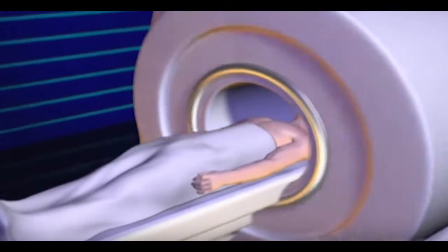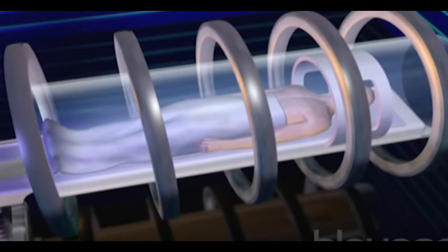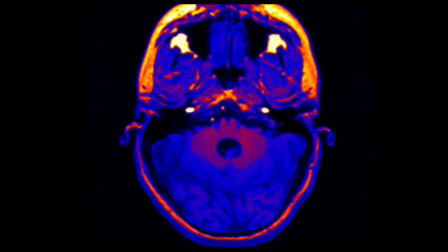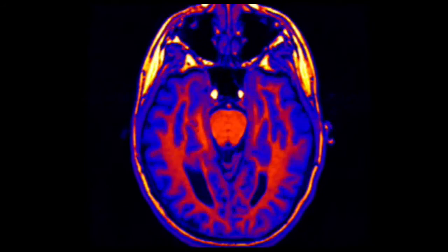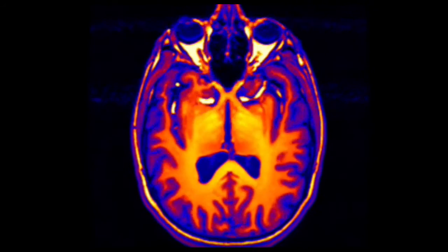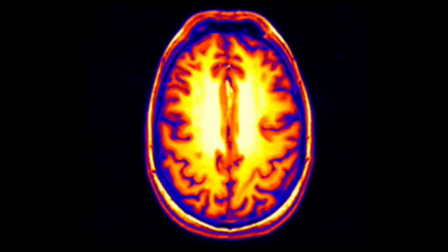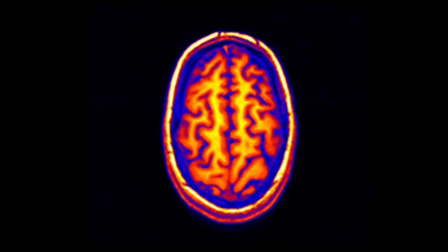MRI scanners employ powerful magnets which produce a strong field which forces protons in the body to align. The protons are then stimulated and sensors in the MRI machine are able to detect the energy release as protons realign with the magnetic field. The time it takes to realign and the amount of energy released changes based on the properties of the molecules.